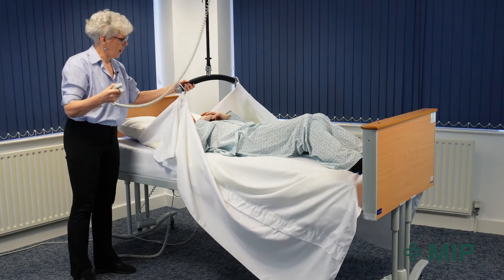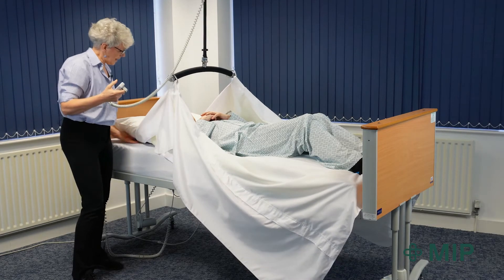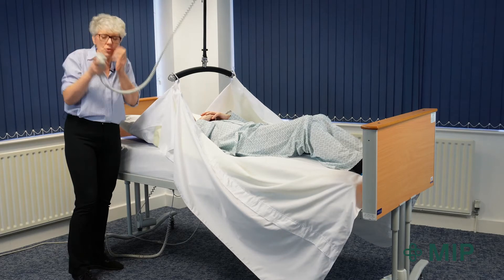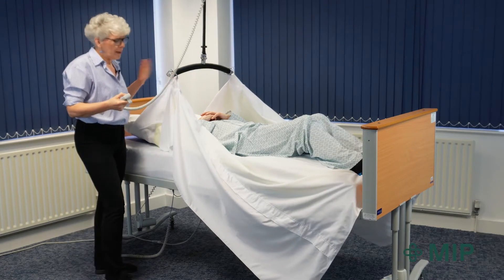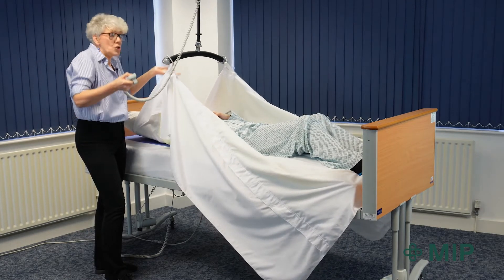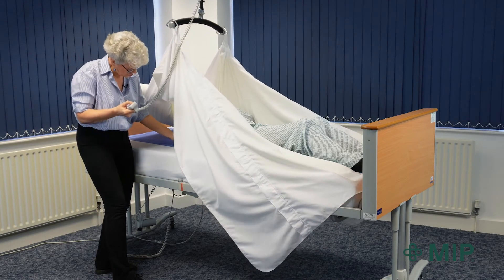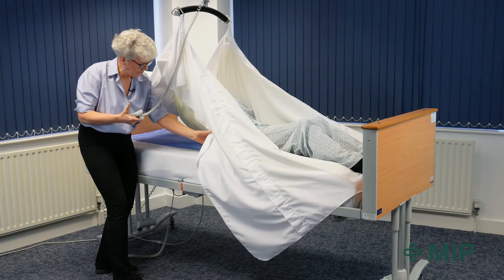Raising the spreader bar up slightly and ensuring that the pillow is still in place will stop him feeling too claustrophobic. All I'm doing is raising up Chris's shoulders off the bed to take some of his weight off the bed. You can just see that his shoulders just come off a little bit.